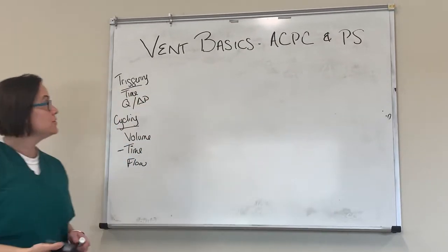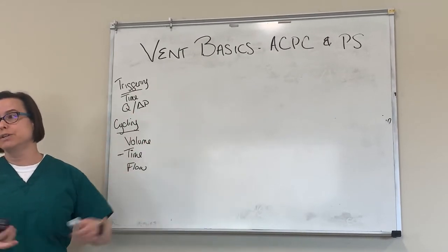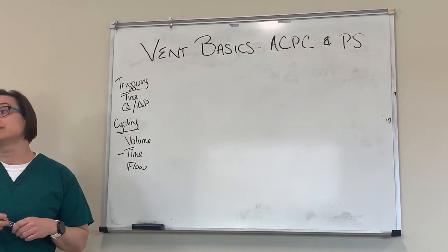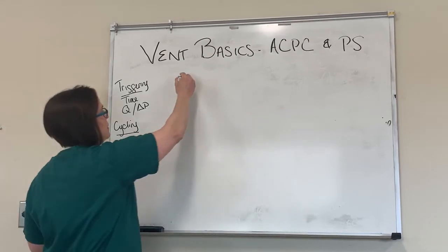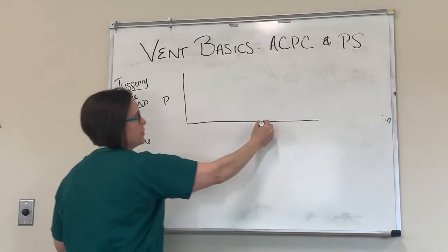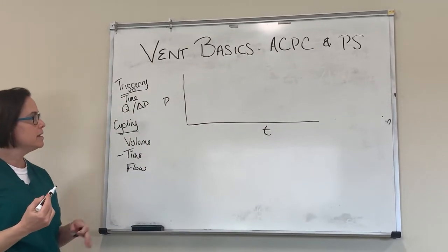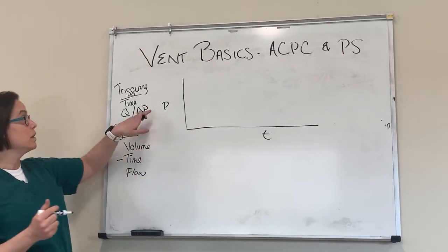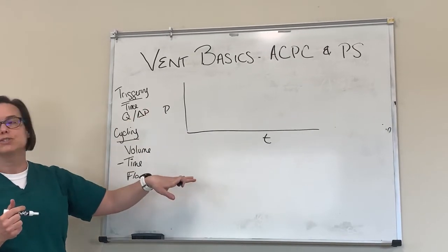And then I also want to talk to you about pressure support, because another lecture we're going to do soon is talking about spontaneous breathing trials, and that's the mode we're going to use for that. So let's talk about that real quick. Okay? So I always like my pressure time curves, right? They help me understand what's going on with my ventilation exactly. Okay, so we said before, either time or a change in flow or pressure could trigger a vent. In pressure support mode, what triggers the vent?